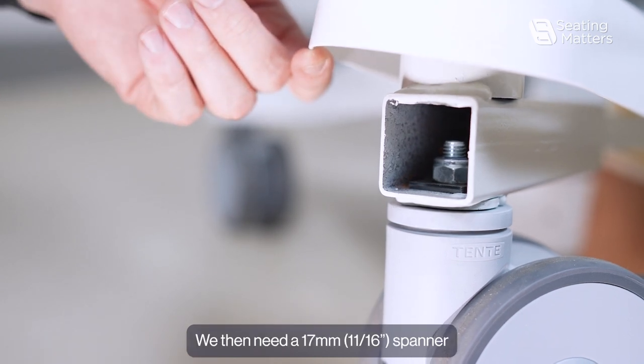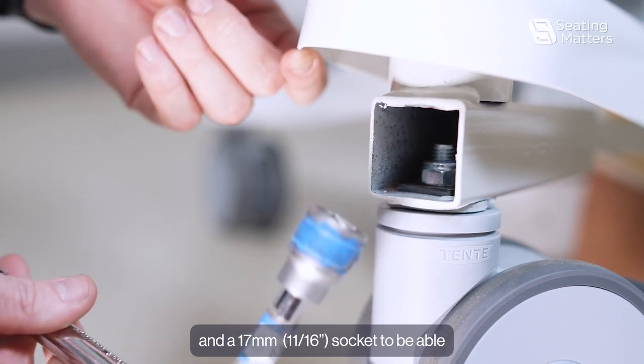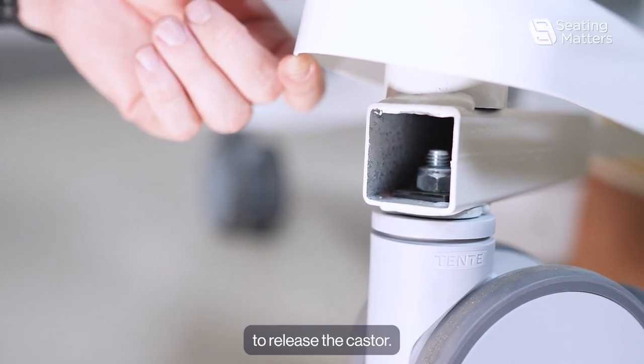You then need a 17mm spanner and a 17mm socket to be able to release the caster.